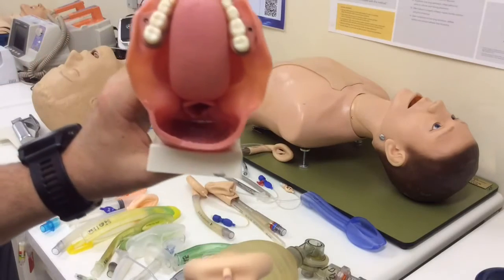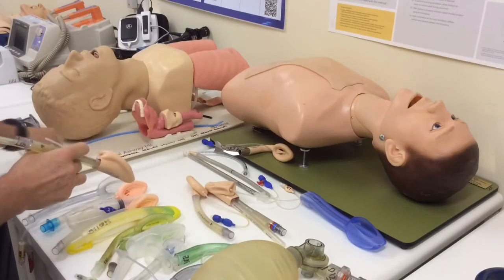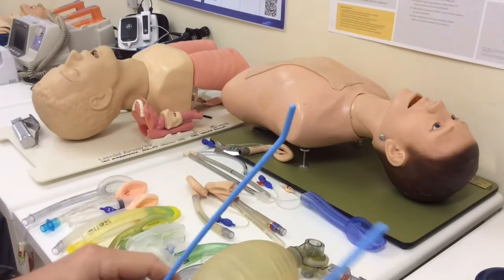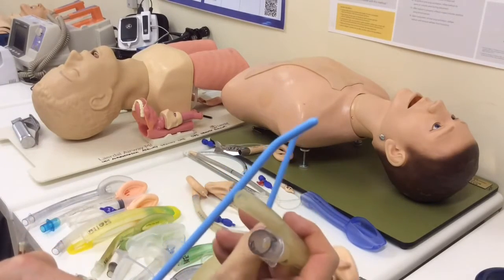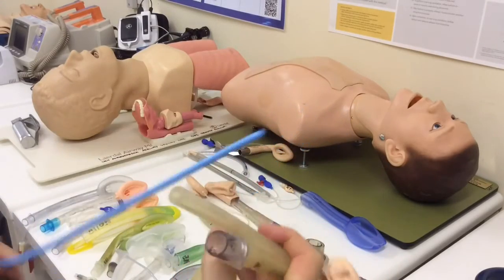So one technique to guide the tip into the esophagus is to use an introducer, some kind of bougie. Now, you'll recognize most of your introducers have got a curved tip on the end, and you don't want to use that end, because that end is designed to get things into the trachea. You want to use the back end as your guide.